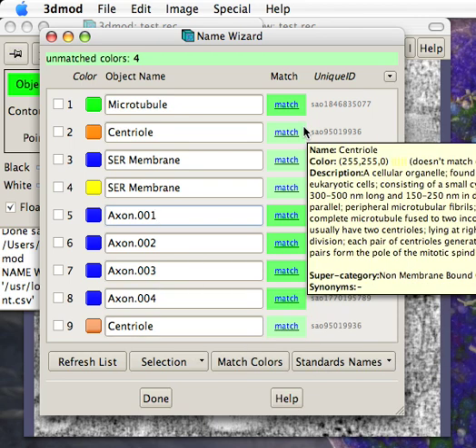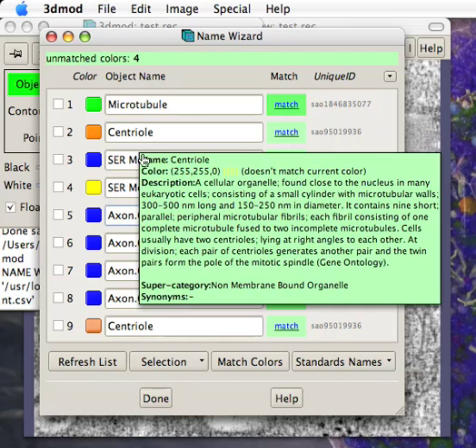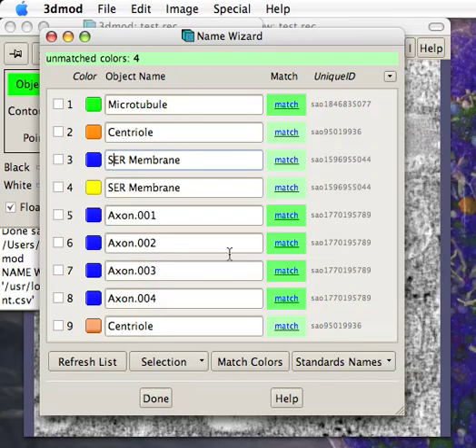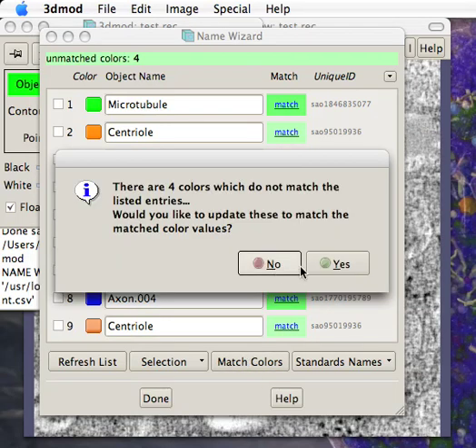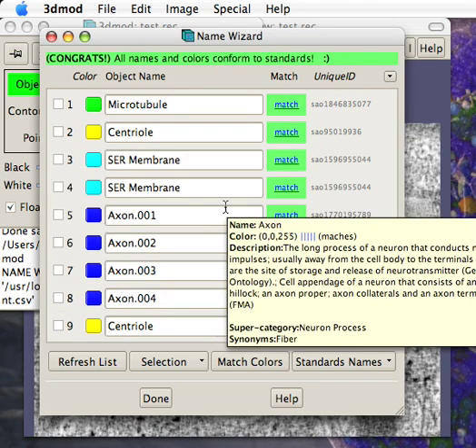You'll notice this is a lighter shade of green. This represents a non-match of color. By clicking match colors, it instantly matches these colors to something we have in our table.